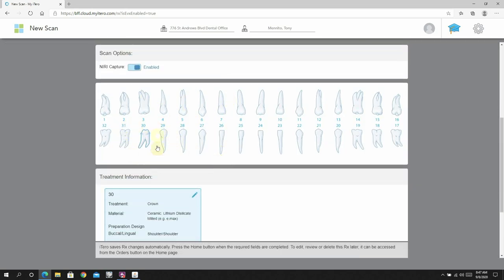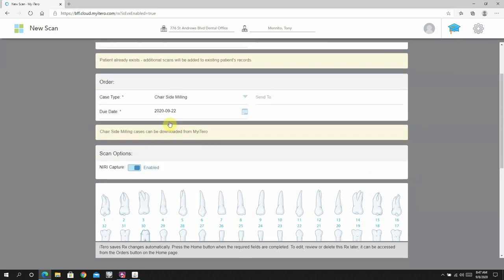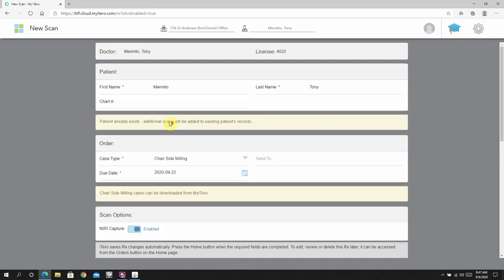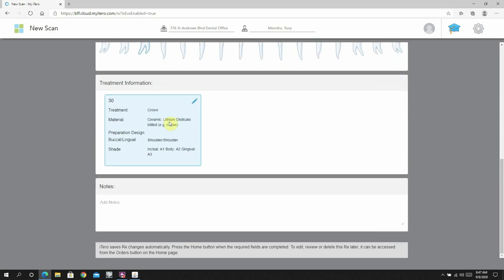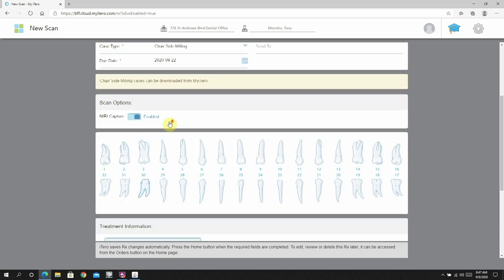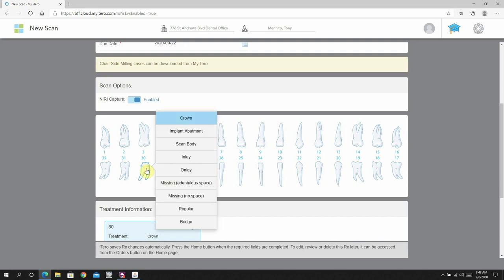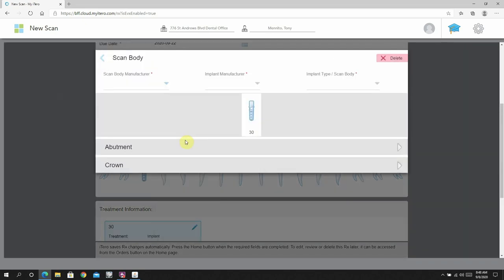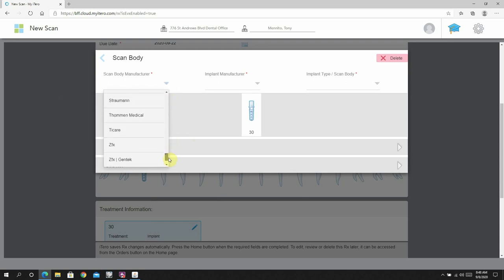The other thing that you can do is there is a nice workflow using implant restorative options that I like to use. There's a company called True Abutment, and what I'm able to do is basically scan a scan body. So do the totally digital implant workflow with this.